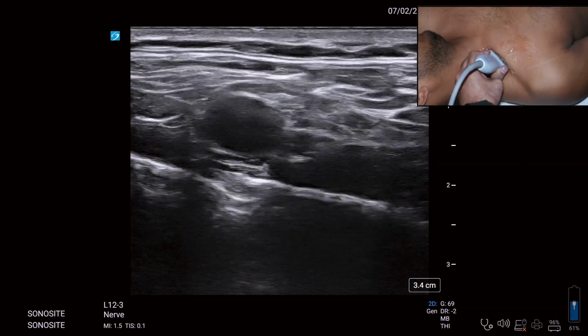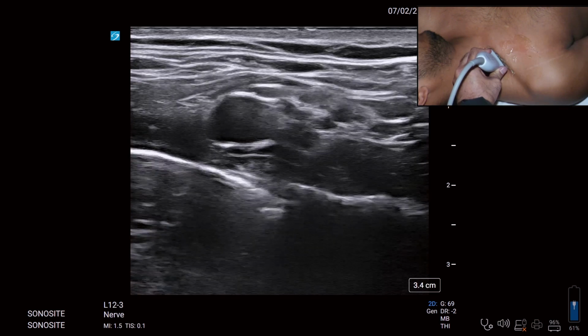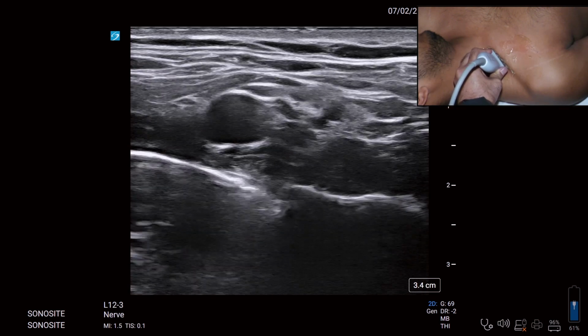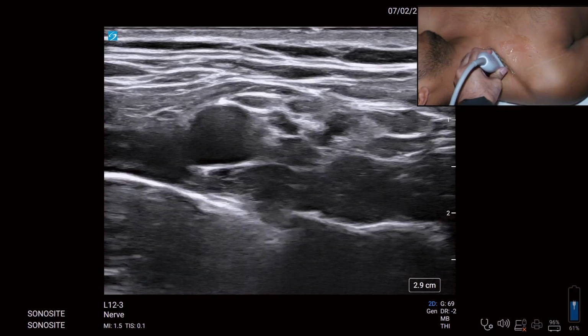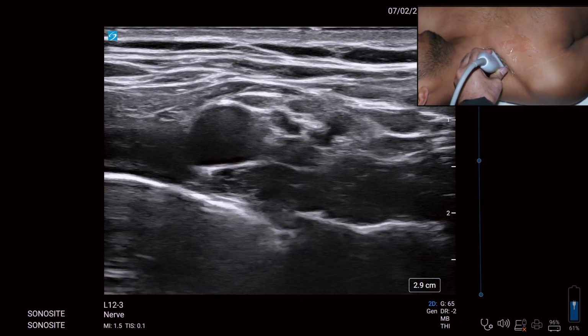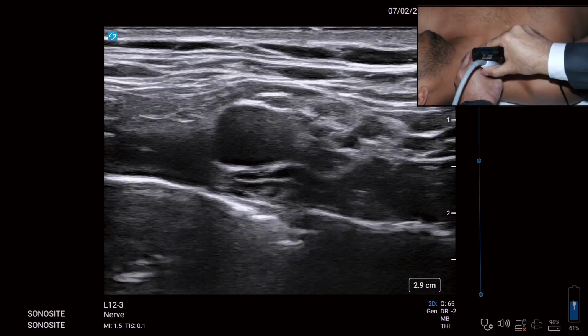This is very important. Otherwise, my corner pocket injection, the corner pocket is the place between the subclavian artery and the first rib. The inferior cord is located like this, inferior trunk. Okay, not, sorry, cord is not there, it's trunks and the divisions which we are talking. So I can injure my pleura. Is it okay? So next is keep scanning upwards.